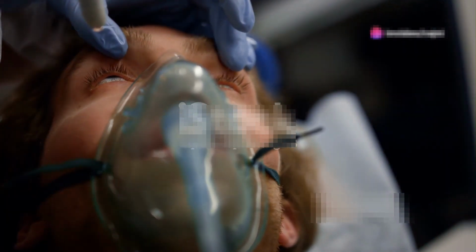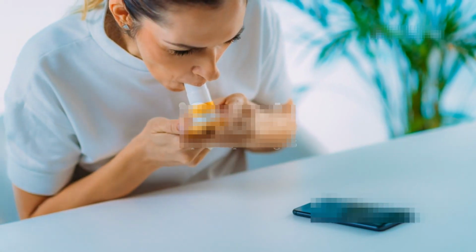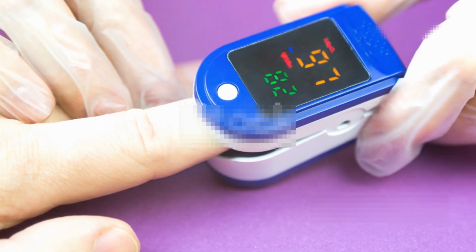Moving on, we have PO2. This measures the partial pressure of oxygen in the blood. Normal range, 75 to 100 mmHg. Low PO2, hypoxemia, if it's below 75 mmHg: chronic obstructive pulmonary disease, COPD, pneumonia, pulmonary edema, asthma, heart failure. Symptoms: shortness of breath, rapid breathing, cyanosis, bluish skin.